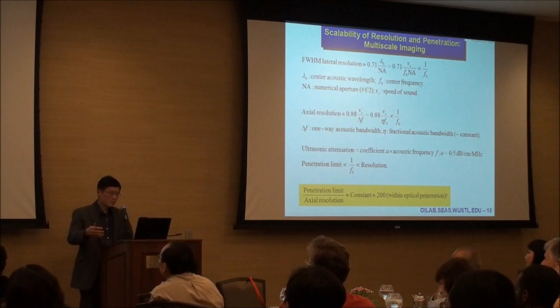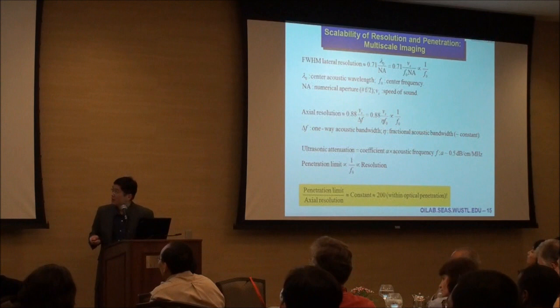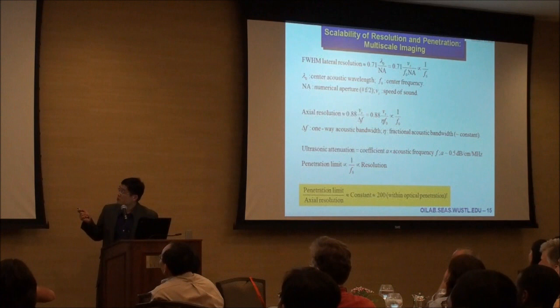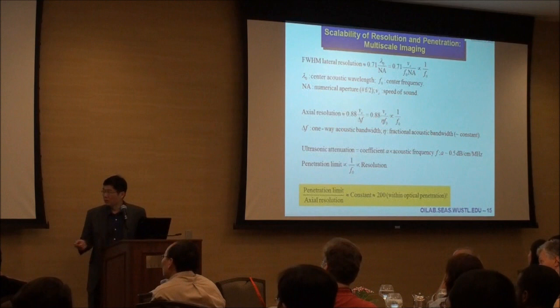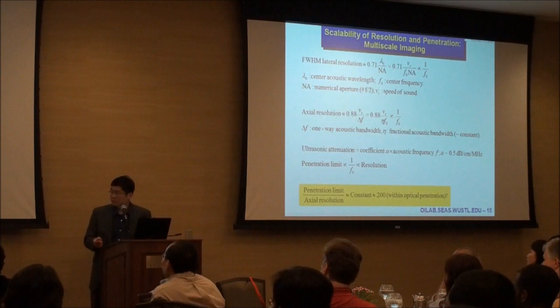So why is photoacoustic tomography so scalable? From the ultrasound side, if you look at the resolution, in the lateral direction, it's inversely proportional to the frequency. So is the axial resolution. You look at the penetration limit, it's also inversely proportional to the frequency. So if you divide the penetration limit by the axial resolution, you get roughly a constant. And very likely, that constant is about 200.